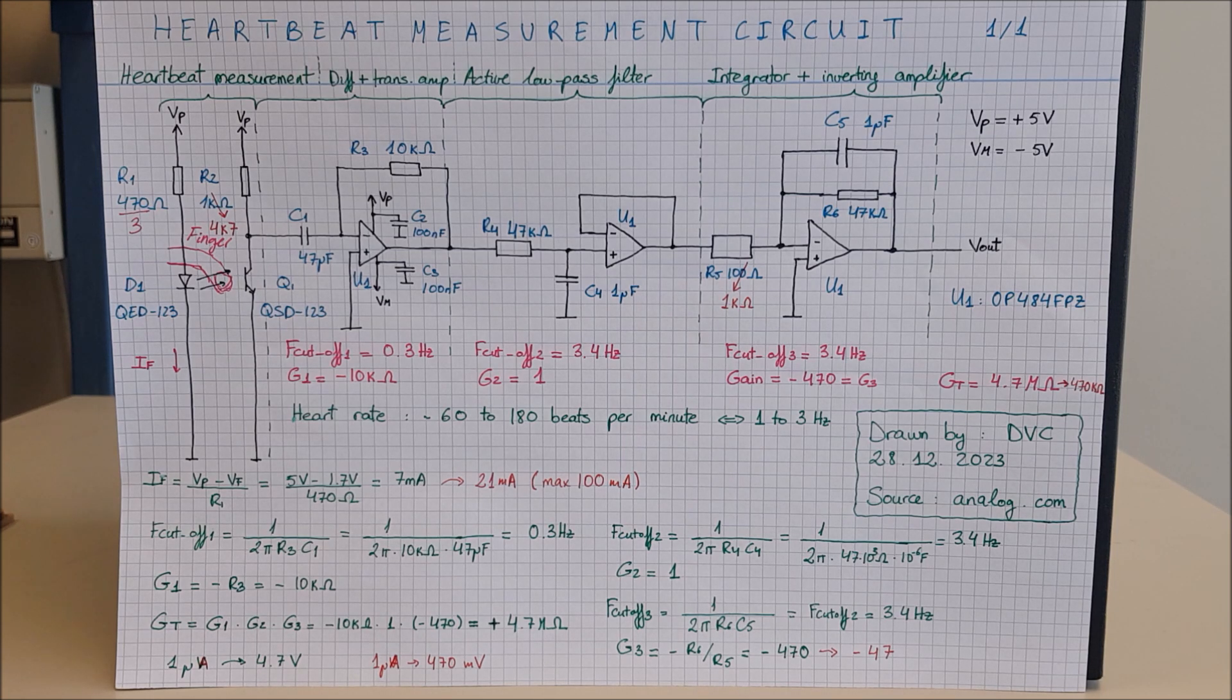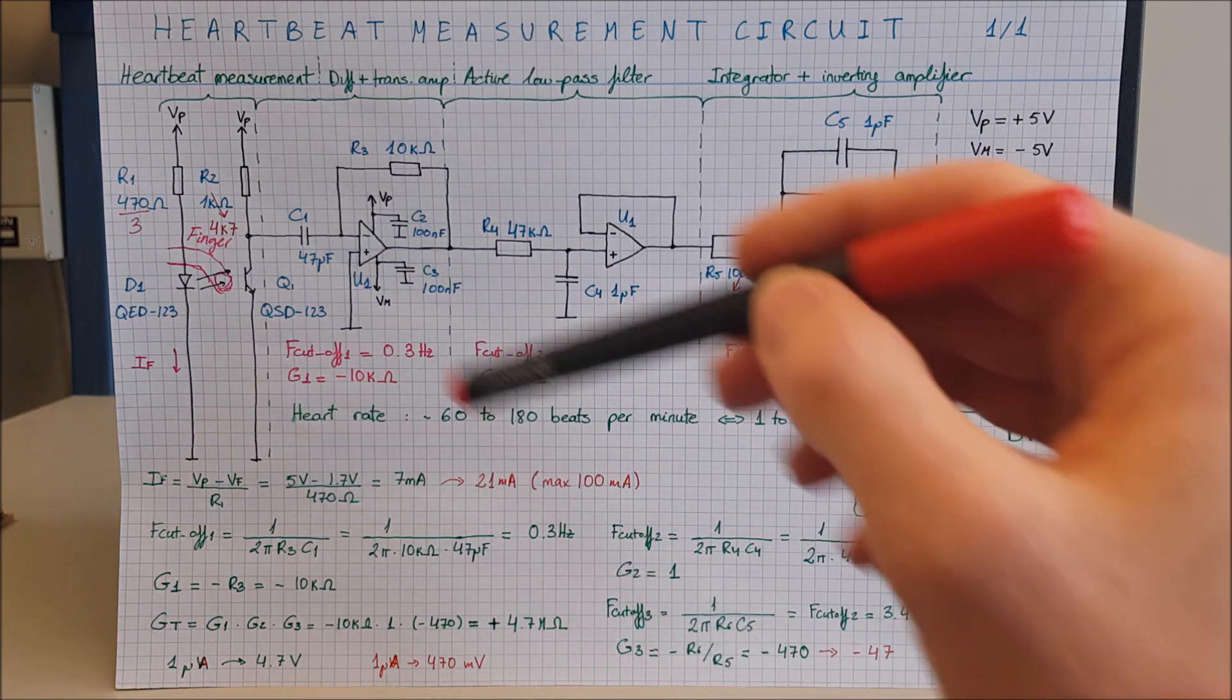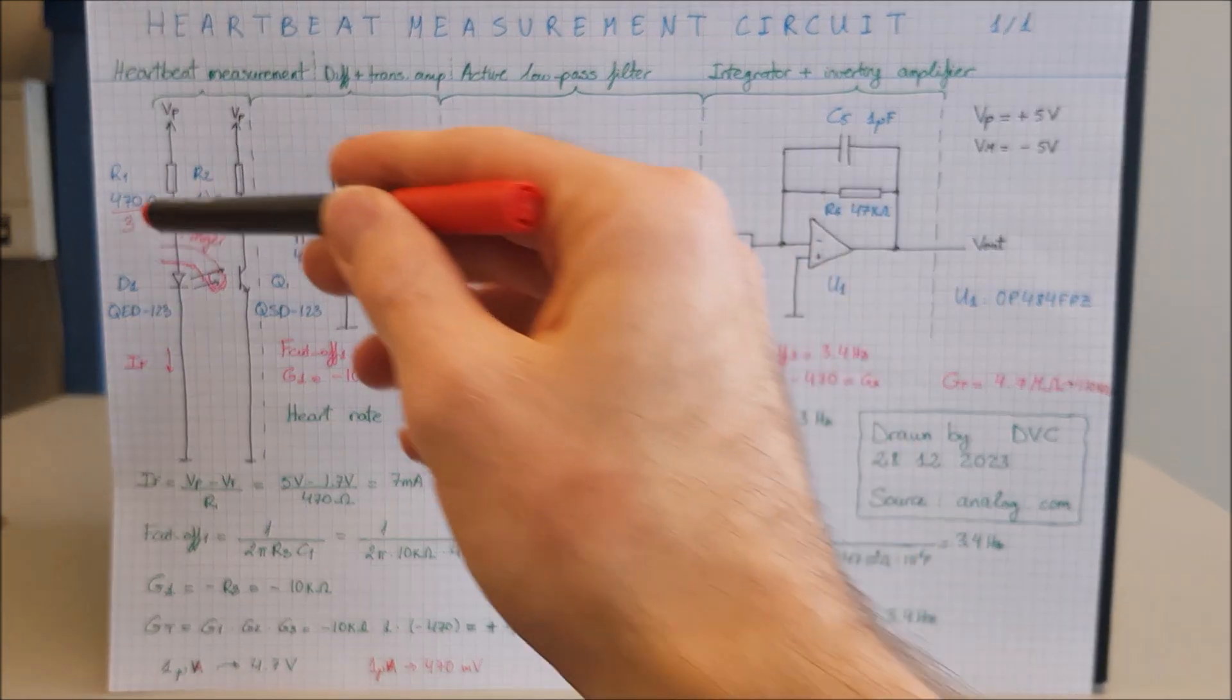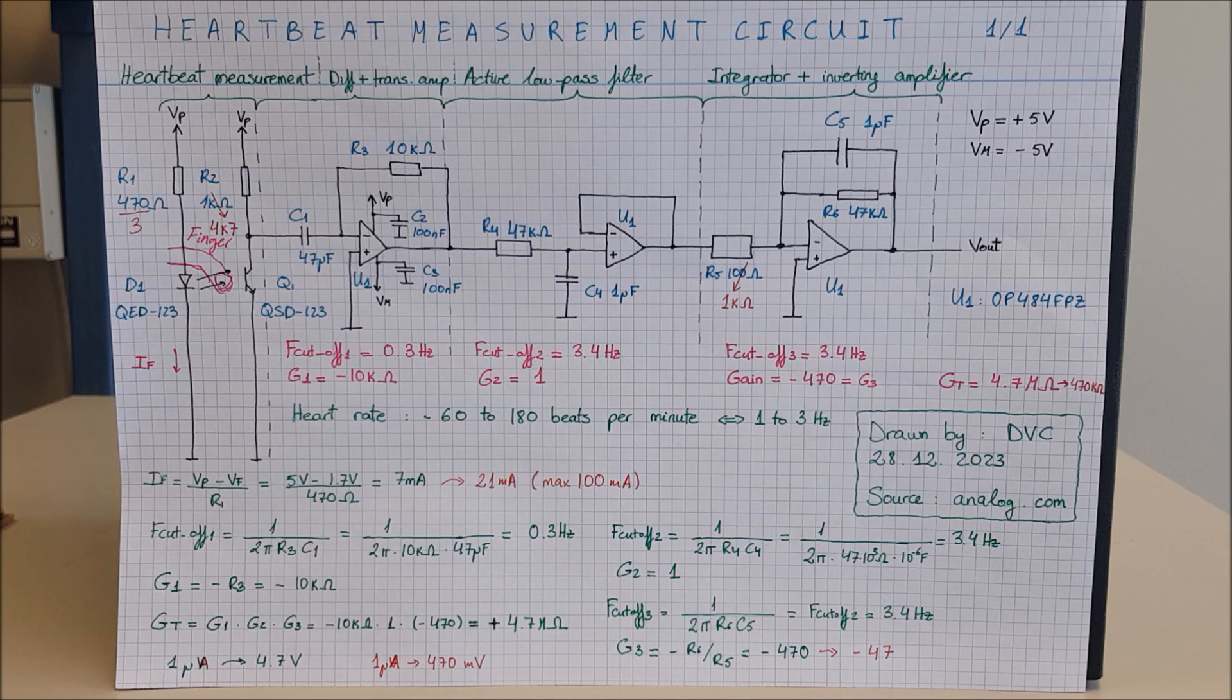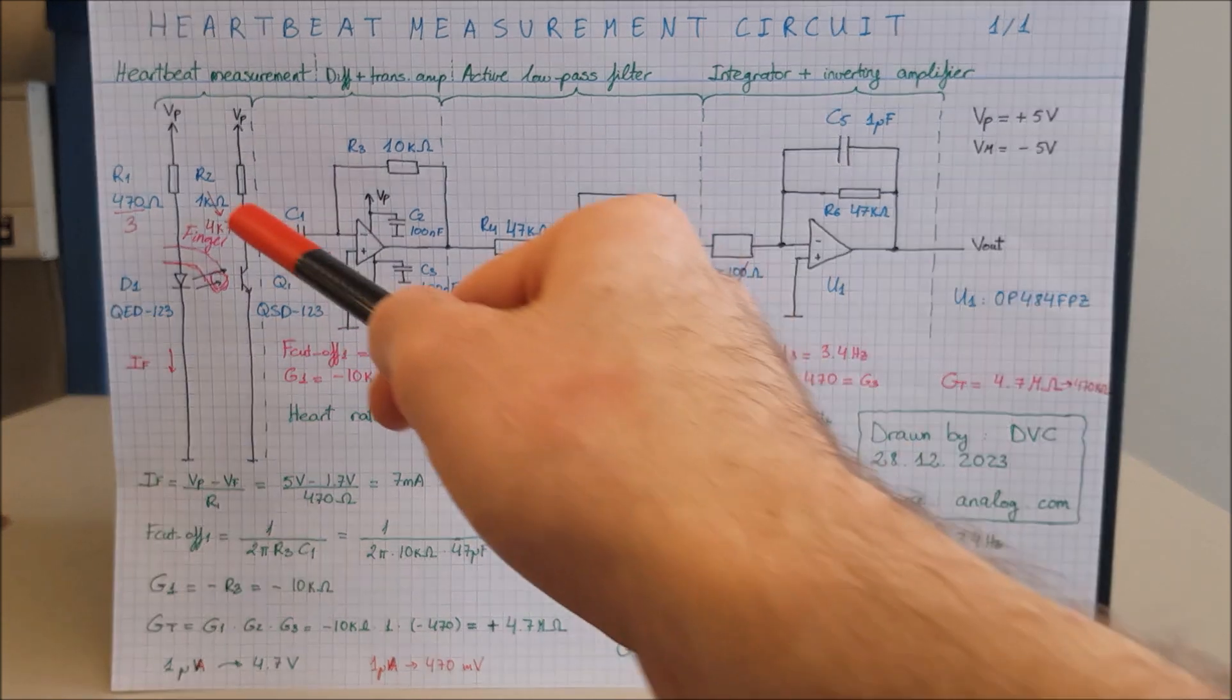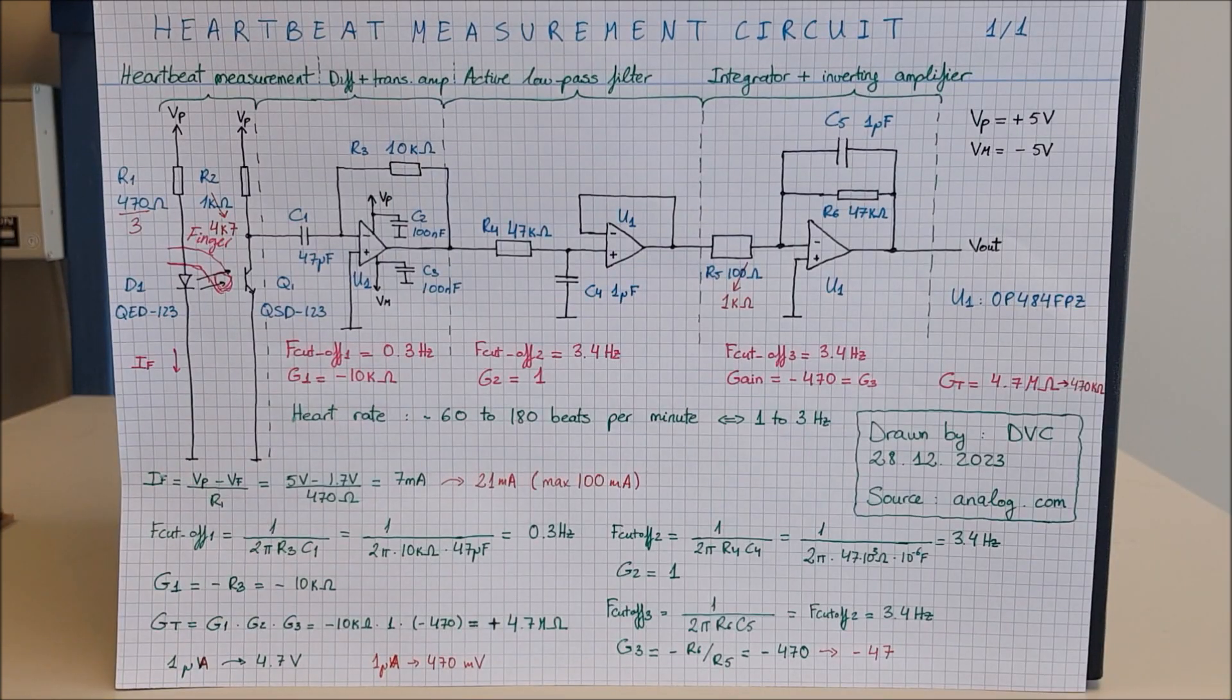I will discuss now the tweaks I have done to the circuit. I wanted more light shining from the LED, so I have connected three R1s in parallel. Therefore, the resistance is 470 divided by 3, which is 21 milliampere. That is okay, because the maximum that the LED can take is 100 milliampere. Next, to increase the sensitivity, I have increased the value of R2 to 4.7 kilo ohms.